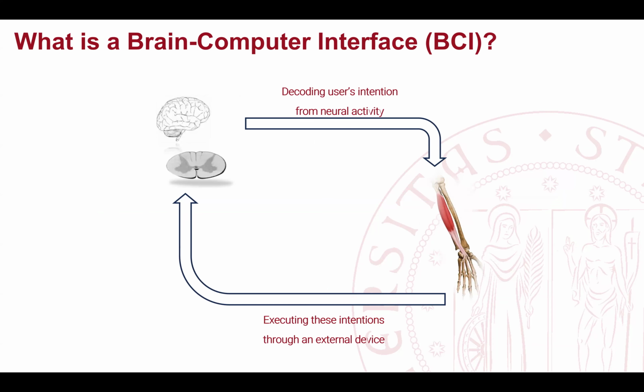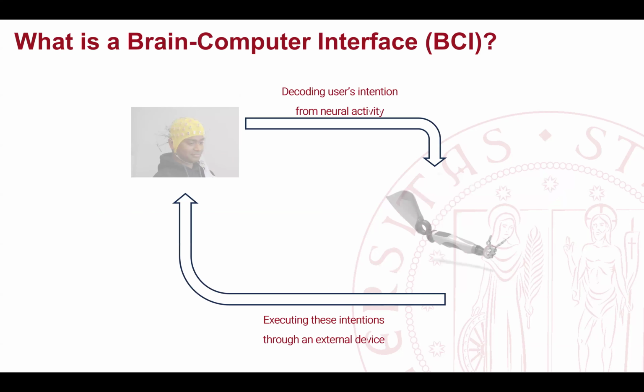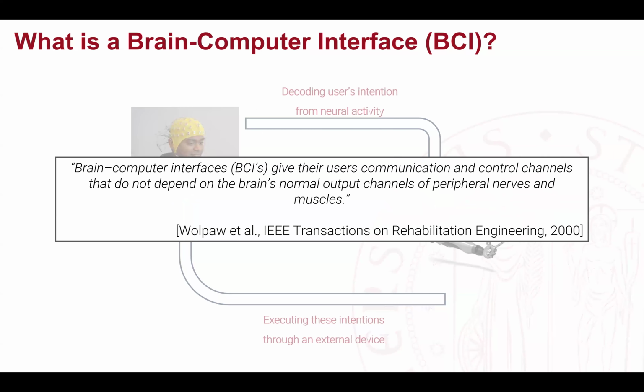One last type of application is the brain-computer interface, which basically allows you to take this data, decode it, and use it in a control loop. I will go a little bit fast on this. This is not really part of this workshop. But basically, the idea of brain-computer interface is to use exactly what I said as an alternative communication means, to use this neural data for communicating directly to a computer device or a robot.